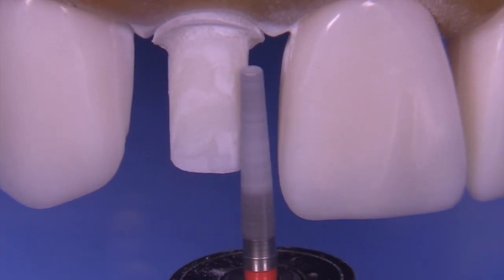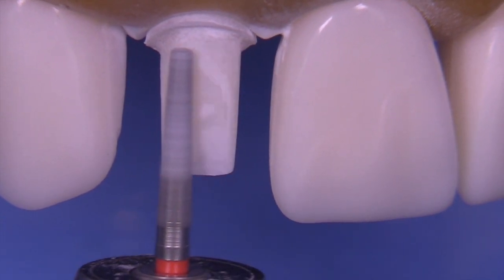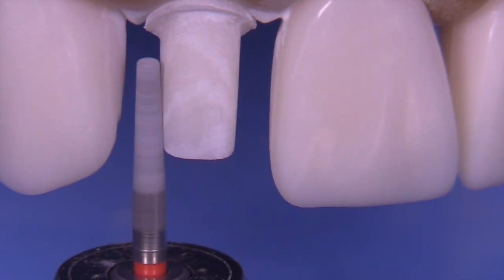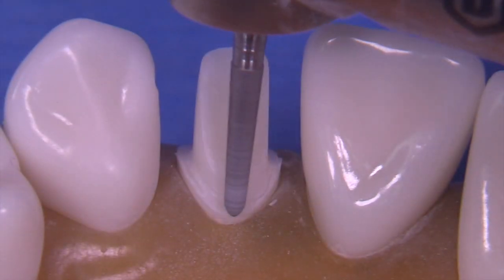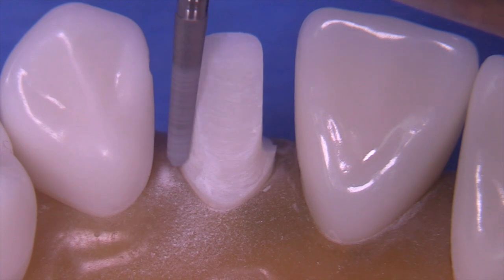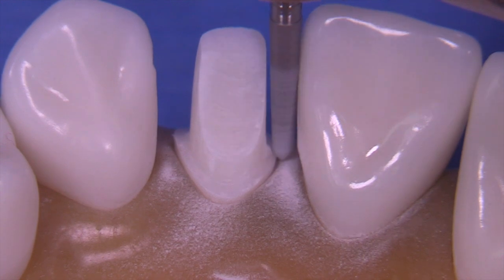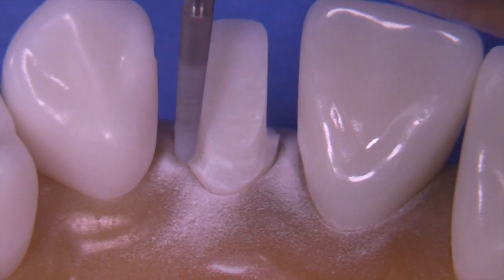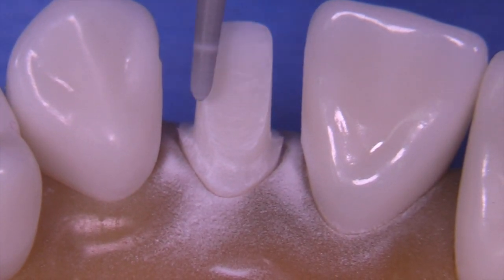Some people like to use a slow speed at this point, but I think a high speed or electric handpiece works out really well. Hold the bur straight up and down along the long axis of the tooth to get the right taper. Let the tapered edge of the bur create the taper that you need. This is just blending the chamfer to the shoulder with that little shoulder-bevel transition area we talked about at greater length on the central.